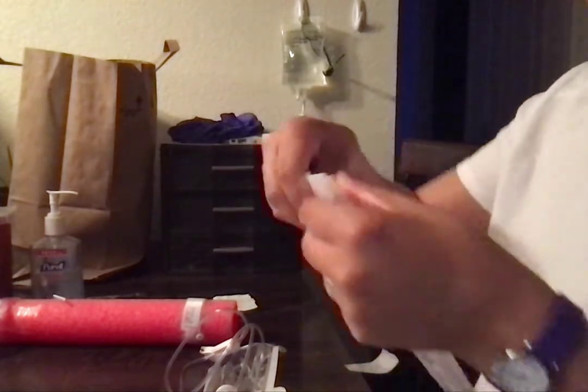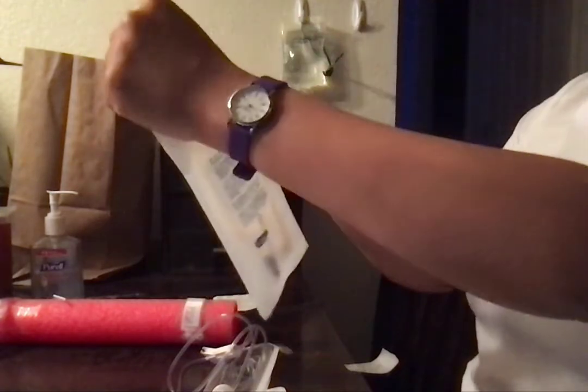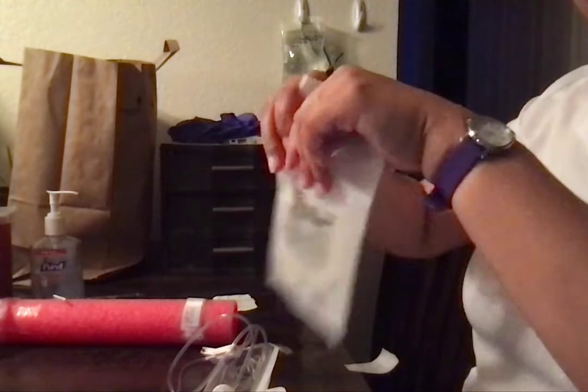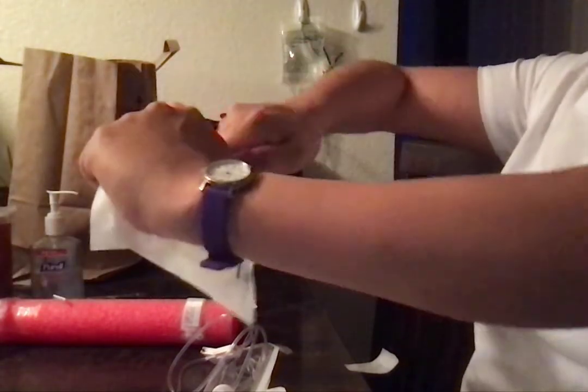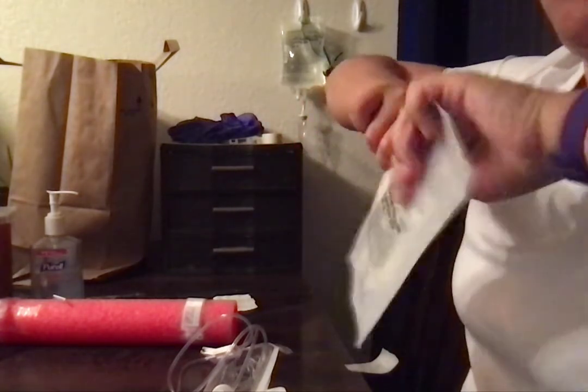Everything is intact there. This bag. Bag really does not want to open. Trying to make sure I don't rip the mini bag.